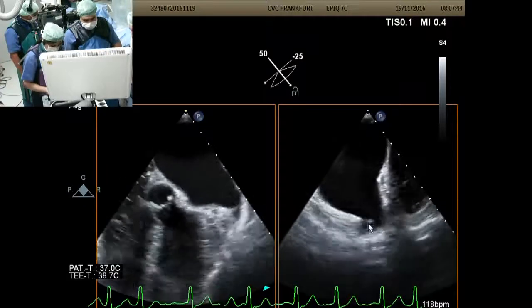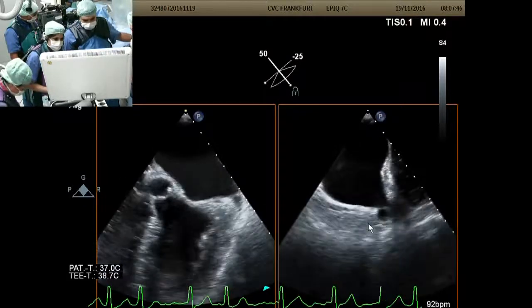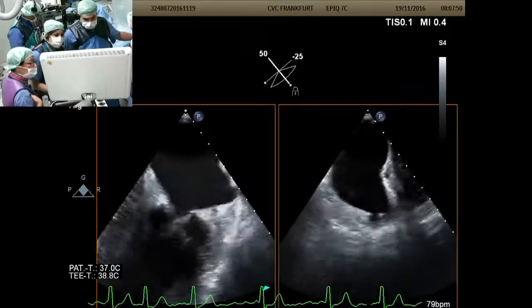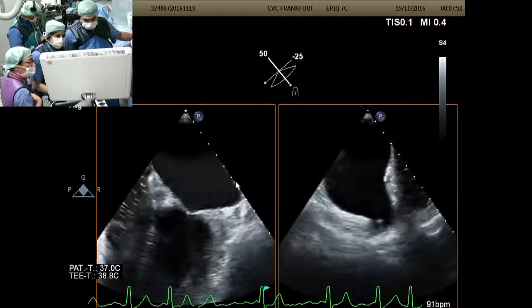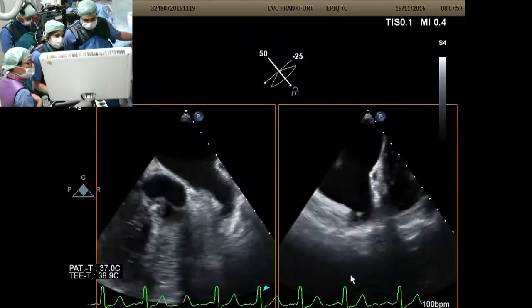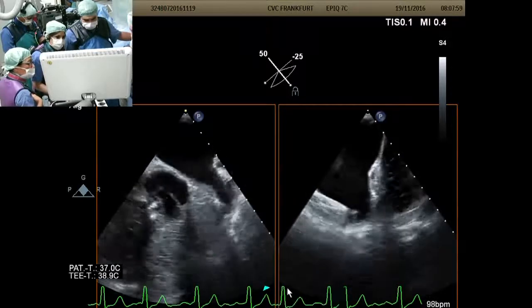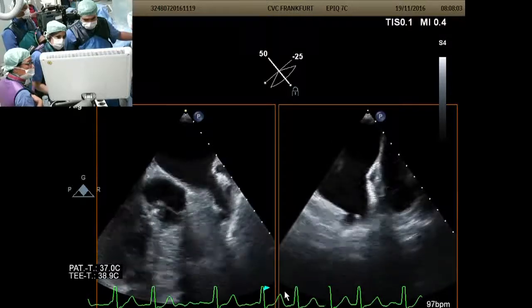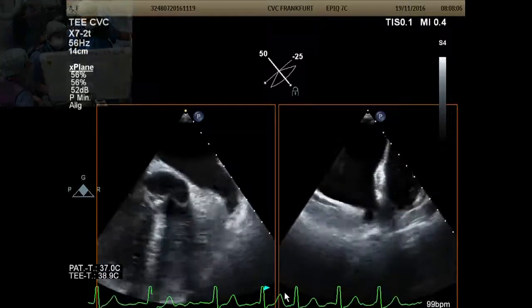Bushra? Yeah. We see a very nice image, but we don't see the angles. I assume you're at... We're at 45, 50. 45 and 135, yes? That's right. 45 here, roughly, and 135 here. Thank you. We have a picture in the corner which obscures... The top left picture needs to be moved to the bottom if they could.